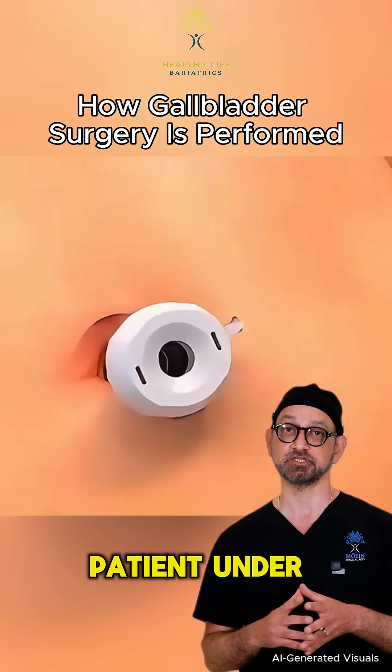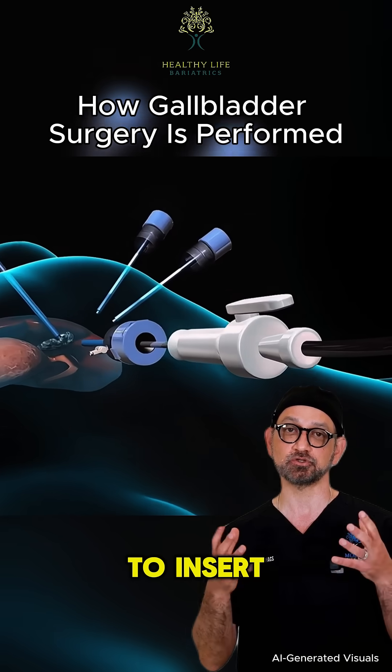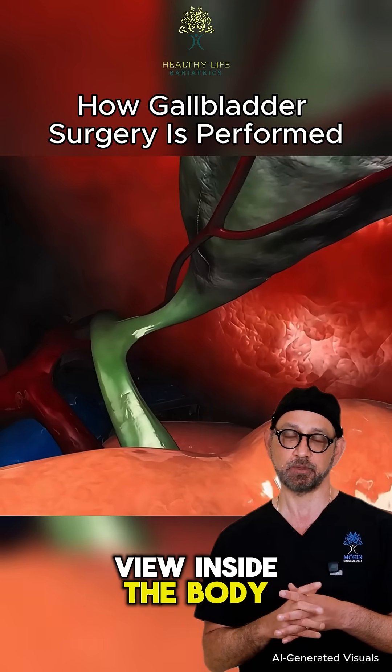We begin with the patient under general anesthesia. Several small incisions are made in the abdomen to insert surgical instruments and a laparoscope, a small camera that provides a live view inside the body.